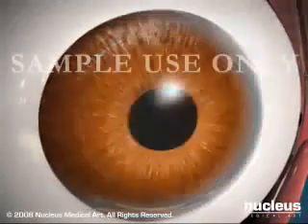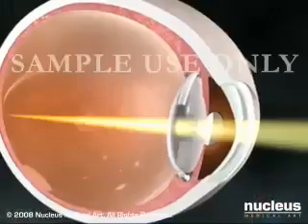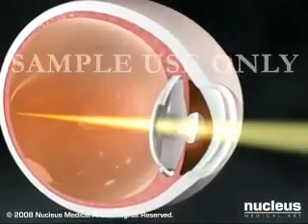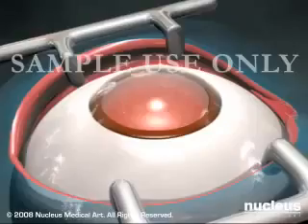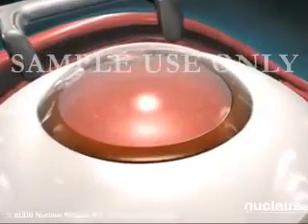Because the incisions are so small, stitches are generally not necessary. Vision often improves notably immediately after surgery. Another method for removing cataracts is called the extracapsular technique.